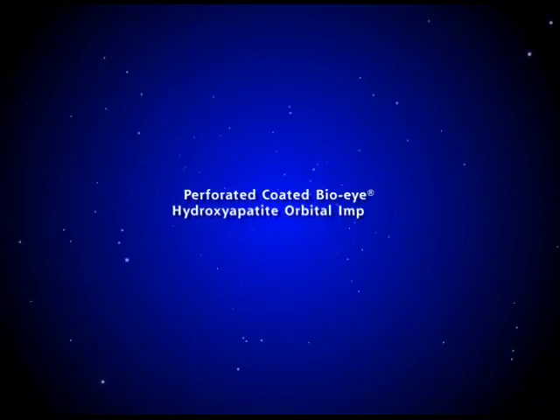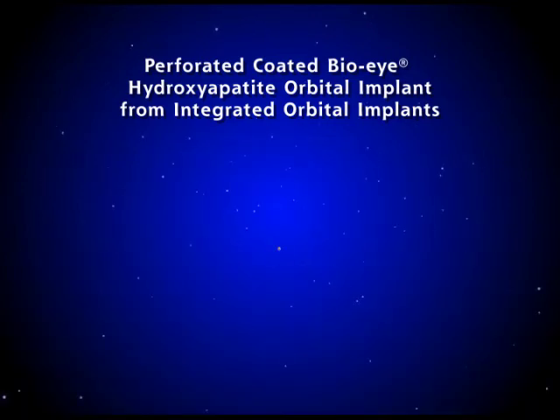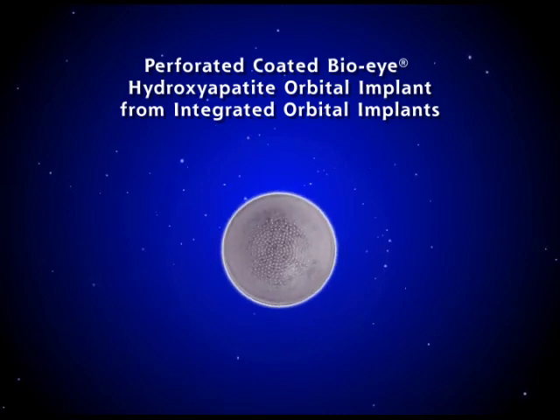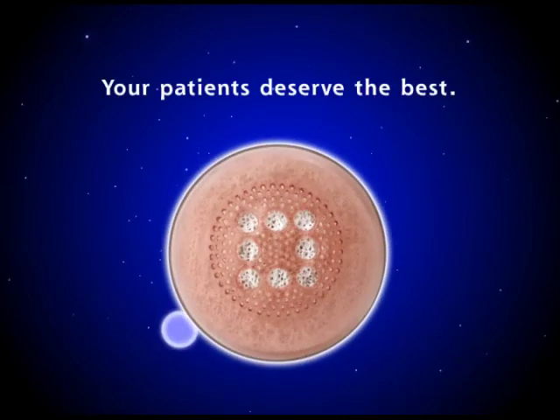The Perforated Coated Bio-I Hydroxyapatite Orbital Implant will provide your patients with the most scientifically advanced orbital implant available. The design makes it easy for the surgeon to use and will decrease operating time. Your patients deserve the best.